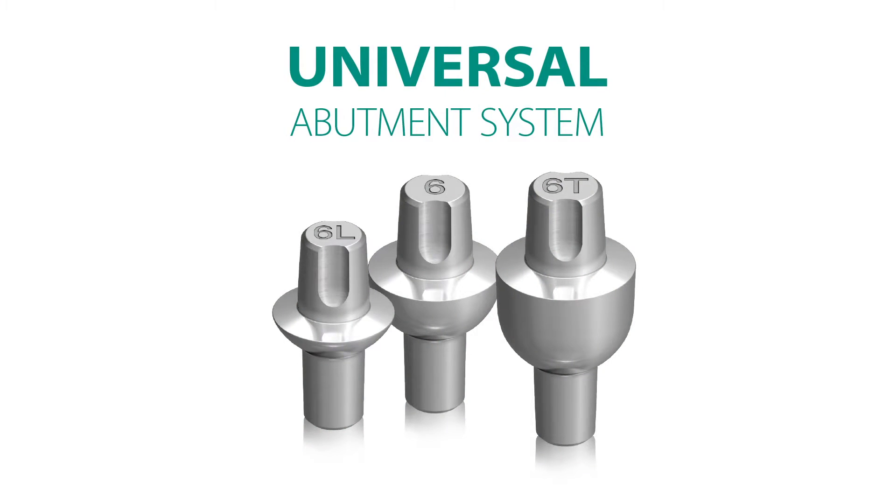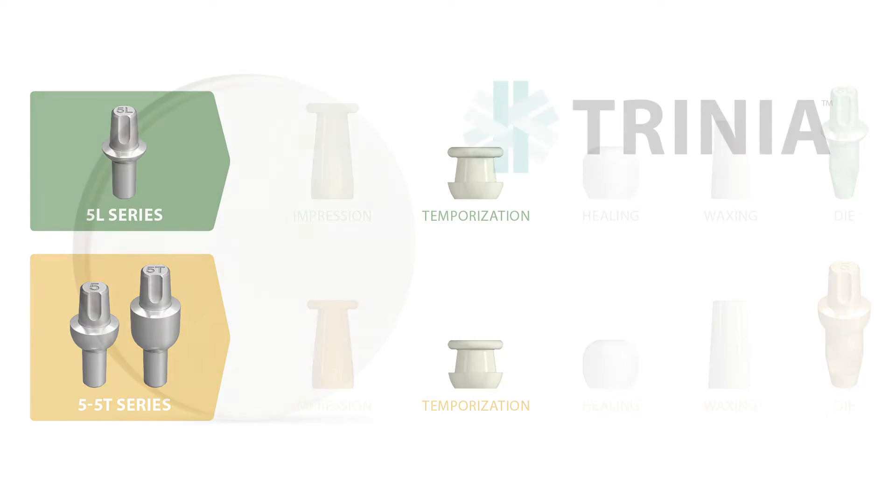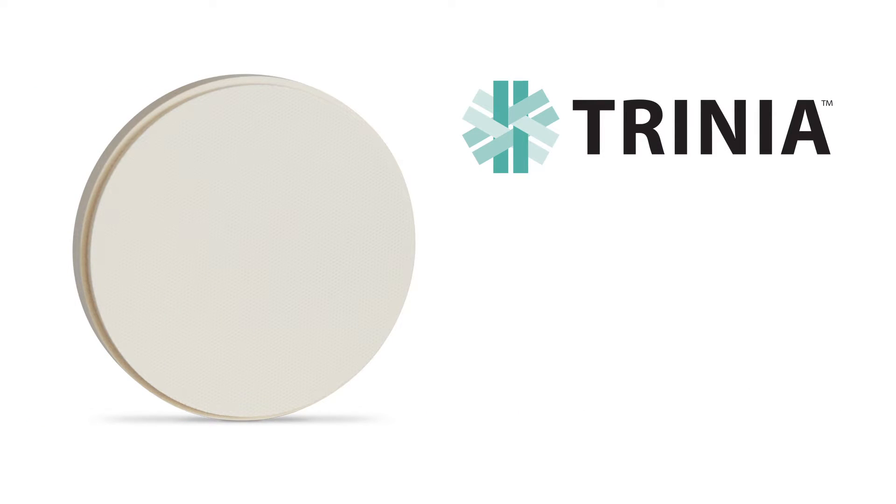Today, the immediate loading of Bicon dental implants can be achieved with greater certitude, facility, and dispatch by using the universal abutment with their temporization sleeves and TRINIA, a fiber-reinforced CAD-CAM resin material. The following clinical cases will demonstrate how these components have simplified and enhanced the immediate loading of Bicon dental implants.